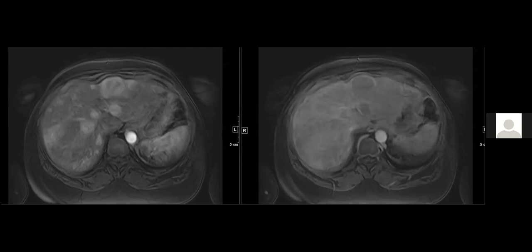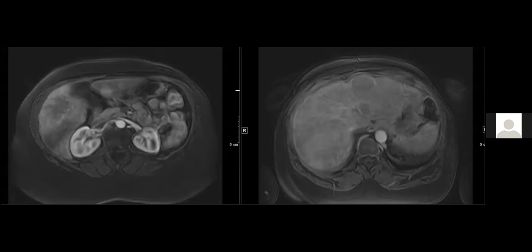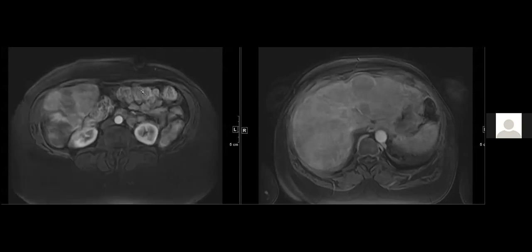Victoria, David has a question. He said it still could be HCC and adenoma, although low intrinsic T1 is unexpected. Say this patient hadn't had liver disease like hep C, and you were thinking about adenoma, do you feel the T1 helps you? No, I don't think so. With this degree of involvement in such large masses, let's say this was a 35-year-old woman on OCPs, I still would want to have a biopsy to confirm. It's true that it could have been an adenoma.